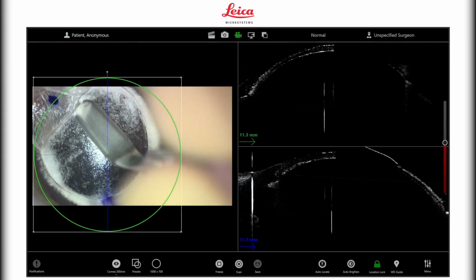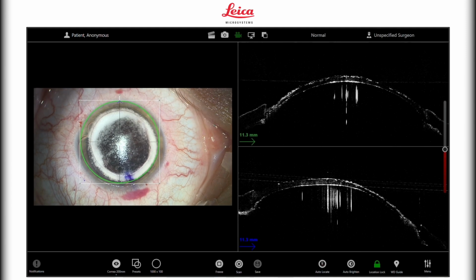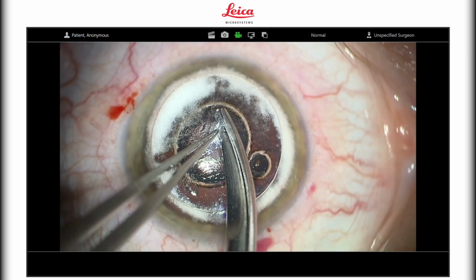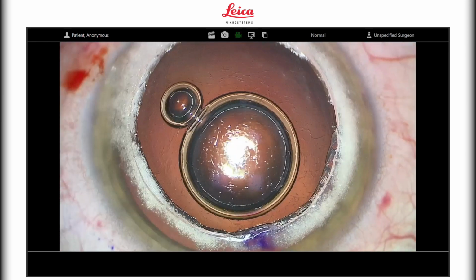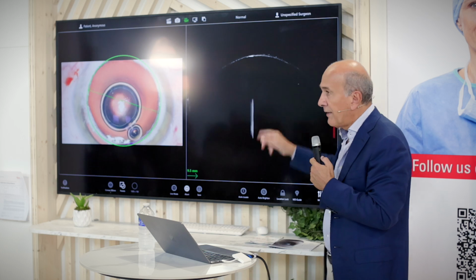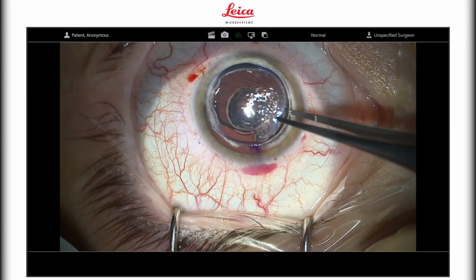So then I proceed, of course, excising the stroma, and I can now open the big bubble, okay? And I cut away the stroma from the recipient, and check whether the surface that I created is very smooth and also very even in thickness, okay?